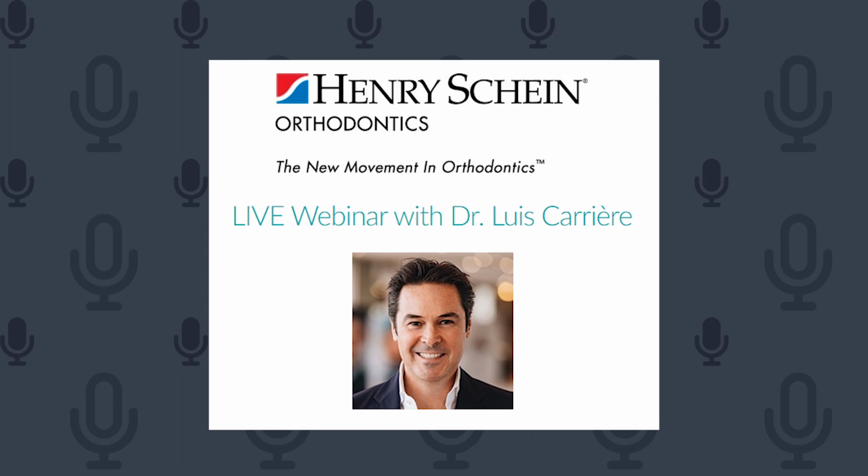Can Carriere Motion cause second molars to impact on first molars in young patients? No, it's not causing that. In fact, the movement that we do is very smooth, it's not aggressive. So we never see that we impact second molars. You will have a beautiful eruption of the second molars after accomplishment of it. So don't be concerned.